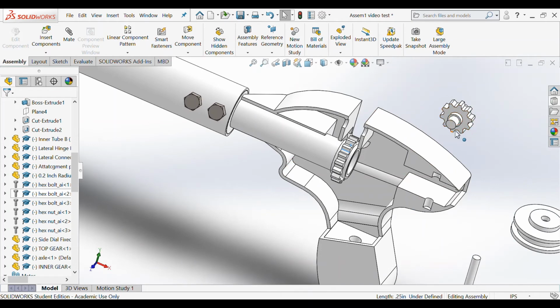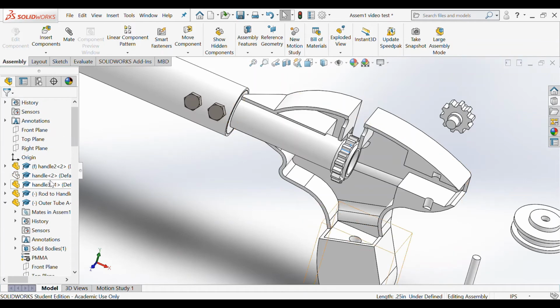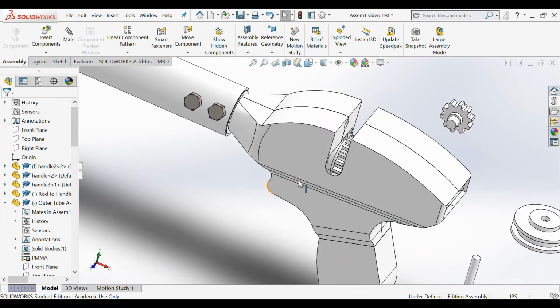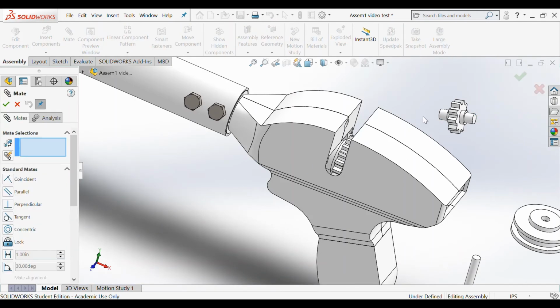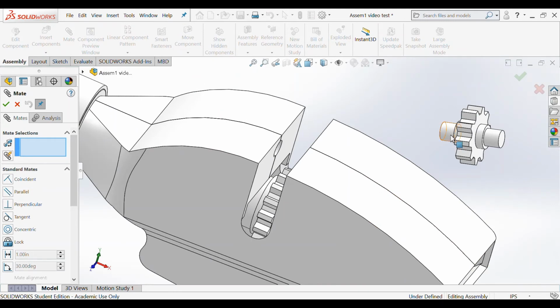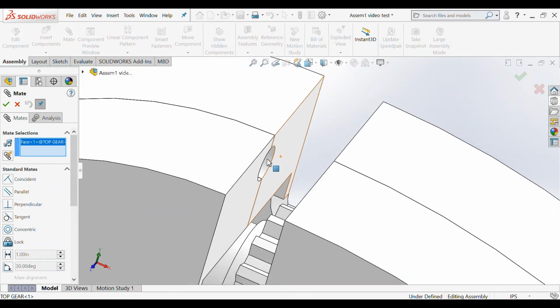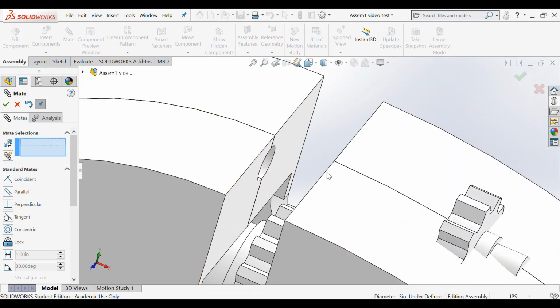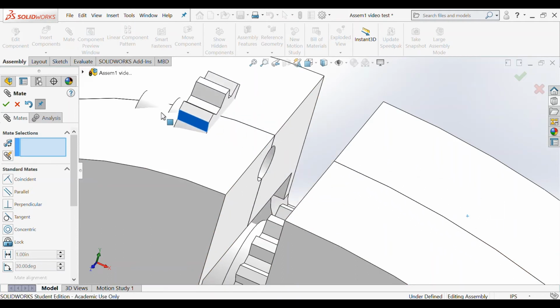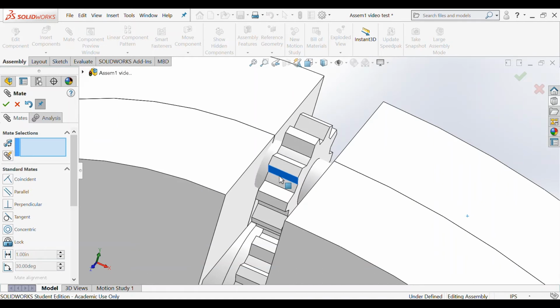Next, I'm going to insert this top gear. So in order to do that, I'm going to make that first piece of the handle visible once again. So I'm going to click this show component, and I'm going to rotate this gear right here into its proper position. And I'm going to choose the outer circular surface and the inner surface here, and I'm going to make them concentric. So as you can see, this guy can move this way and this way, but it's still concentric.